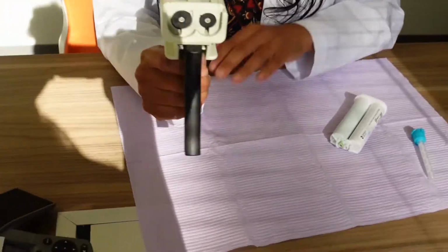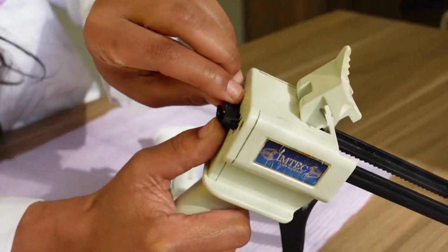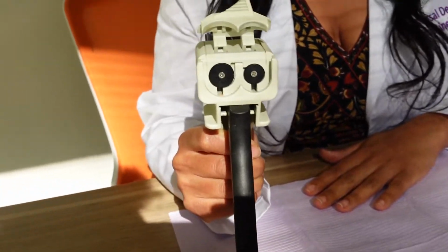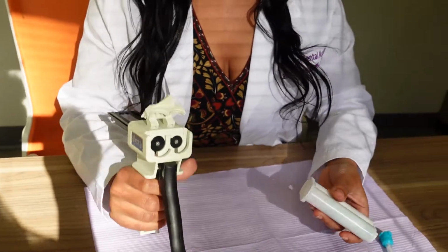See that? Pull it out, push it in. This button is up, pull it out. Now the actual material can fit in there. So we're gonna load it. This is how you load it. This is a gun. This is how you load it.